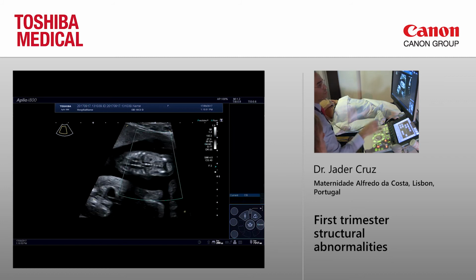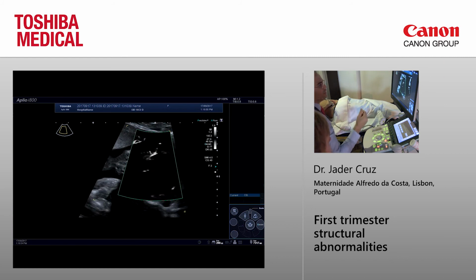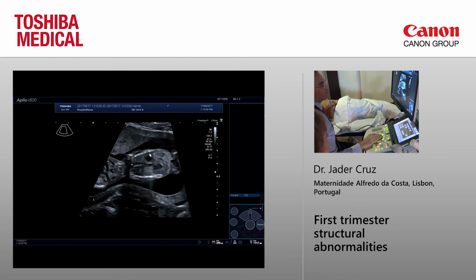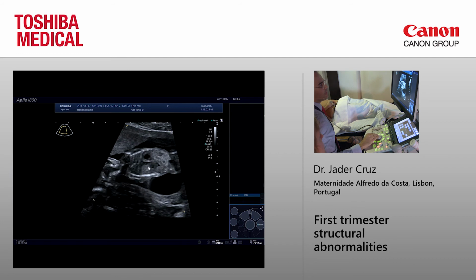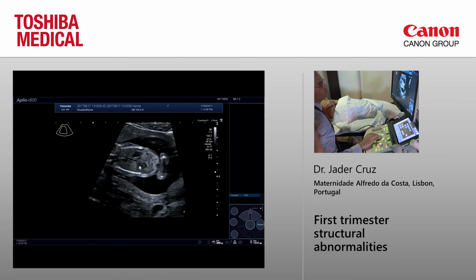For the heart, this is the old SMI. Is that right? Yeah, this is the old SMI. You see the difference in the quality of images. The new one is really nice. You can see there the diaphragm. You can see the lungs, bowel, liver. Nobody cares about liver.